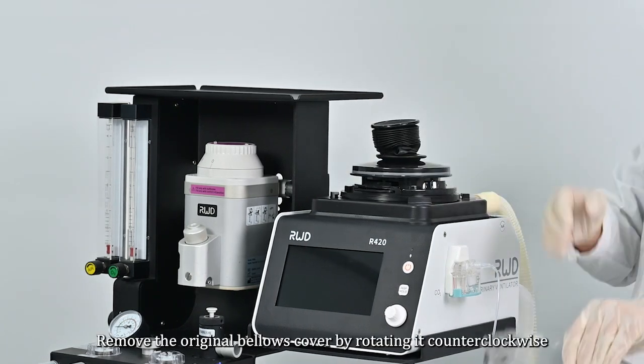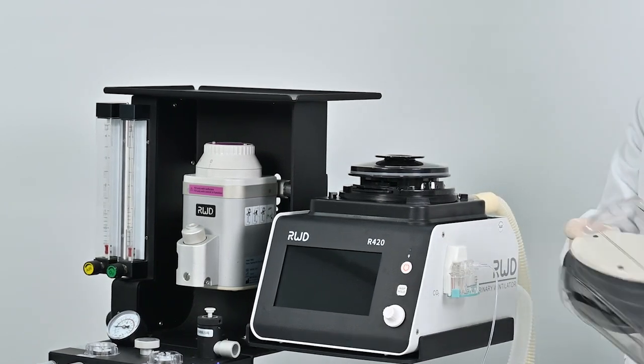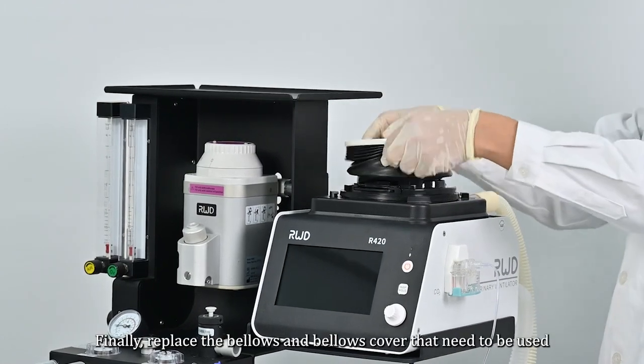To replace the bellows, remove the original bellows cover by rotating it counterclockwise, then pull out the folding pouch directly. Finally, replace with the bellows and bellows cover that need to be used.